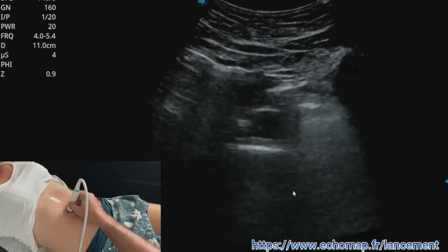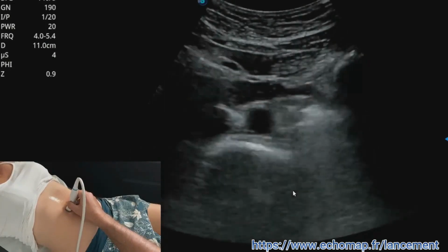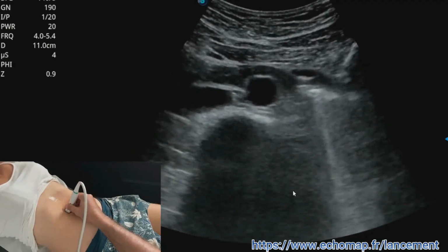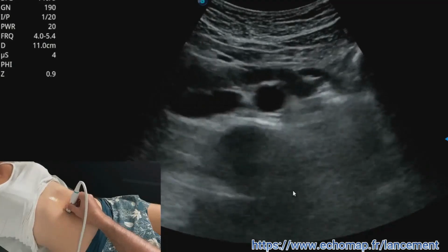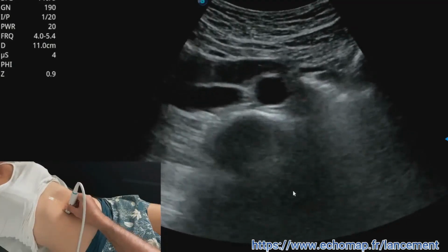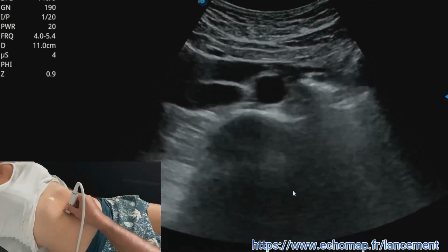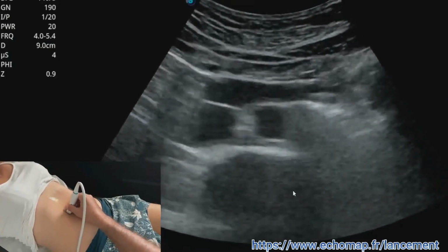If you're losing out on digestive gas, you can think of several things. Adjusting your image and focus. Think about its perpendicularity and sometimes press a little bit, because you're going to chase digestive gas. We don't press too hard. It doesn't hurt the patients. And then you see that we bring it up a little bit in the image. It improves our image and we chase away digestive gas. So that's pretty good.